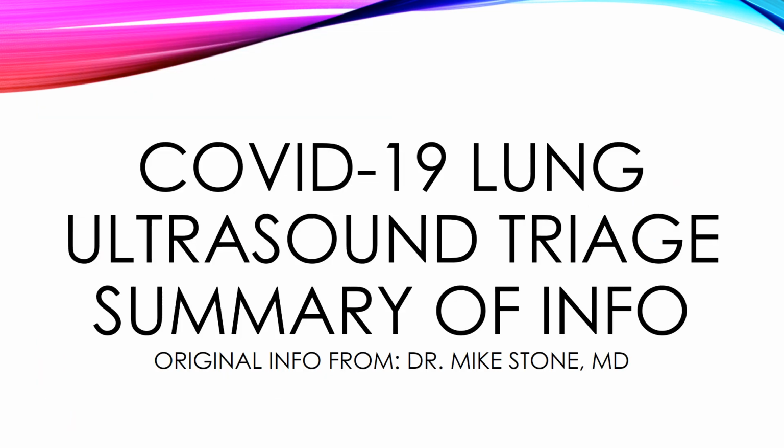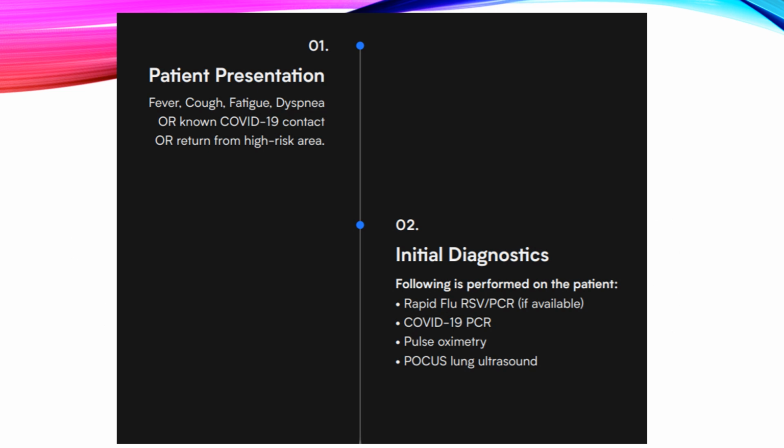So there is a triage summary, and this is from Dr. Mike Stone, also from Butterfly Ultrasound. So what we have developed is, say a patient is going to present. We have our COVID tents here. They're going to present with symptoms typical for COVID, including cough, fever, fatigue, dyspnea. If they have a known COVID contact, if they went to a high-risk area, or if they're a health provider who has a lot of contact with COVID, then we're going to do the initial diagnostic.